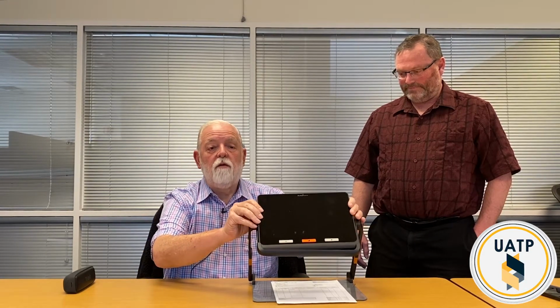Explorer 12. 12 stands for the 12-inch diameter or 12-inch diagonal screen that it has. It is a video magnifier which is designed for people who have very low vision and who need some significant magnification. I want to just show you this device is designed to be used several ways.